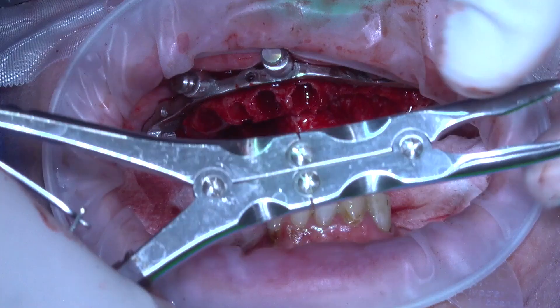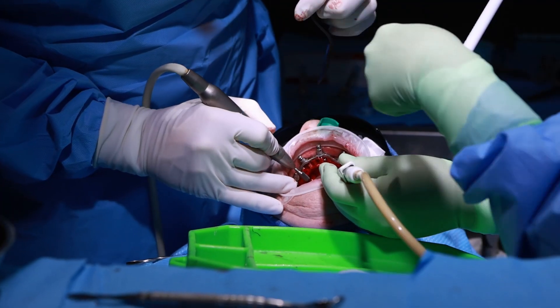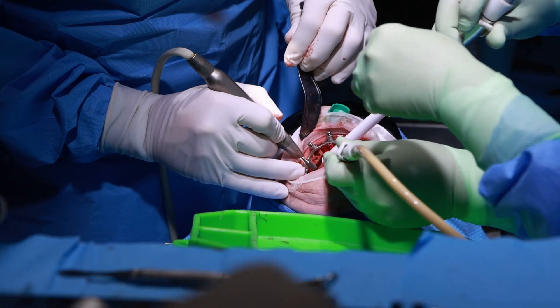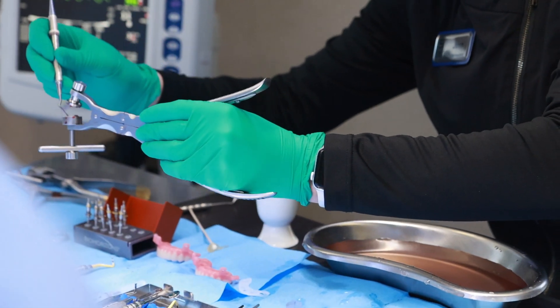Here's how to use a bone mill. First, you need to harvest the autogenous bone. The best way is a double action rongeur — double action means it has two hinges. You just want to nibble on it. If you're doing a full arch or full mouth case, you'll get plenty of this when you reduce and level the bone on the ridge. Once you've harvested the bone, you'll pick up pieces of it with forceps, place them into the body concavity of the bone mill, and pack the bone snugly.